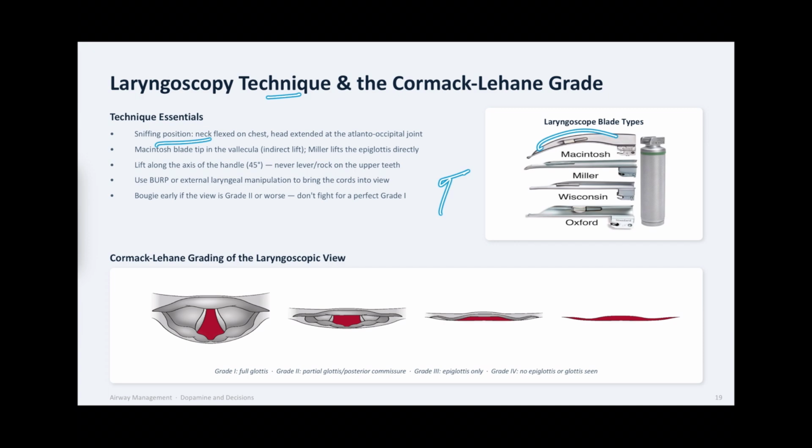Your goal is not to force a grade 1 view. Sometimes a grade 2 view is perfectly acceptable if visualization is adequate. Use external laryngeal manipulation if only the epiglottis is visible. Introduce a bougie early rather than repeatedly attempting direct tube placement. Remember this principle: first pass success matters. Every additional attempt increases the risk of hypoxia, aspiration, airway trauma, and mortality.